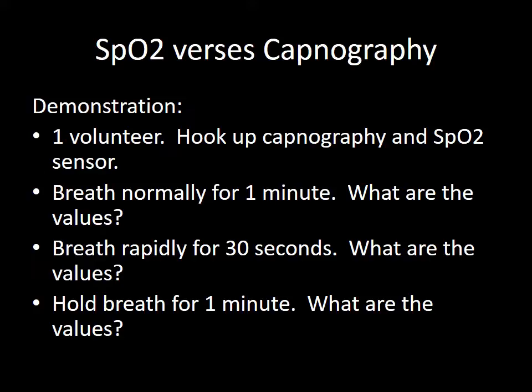With capnography, the 30 seconds is going to alarm and tell you this patient's not breathing. Honestly, sometimes it's hard to see that in the back of the ambulance. That's a great value of capnography: you can monitor their ventilations better than with just your eyeballs, and certainly better than with SpO2.